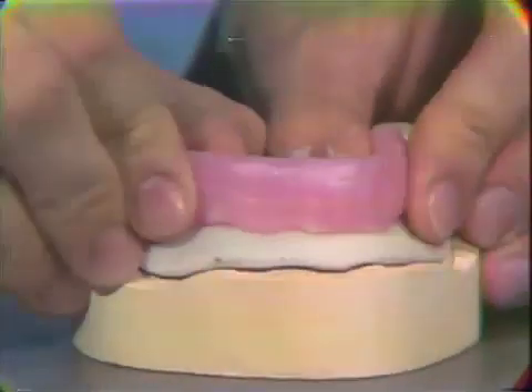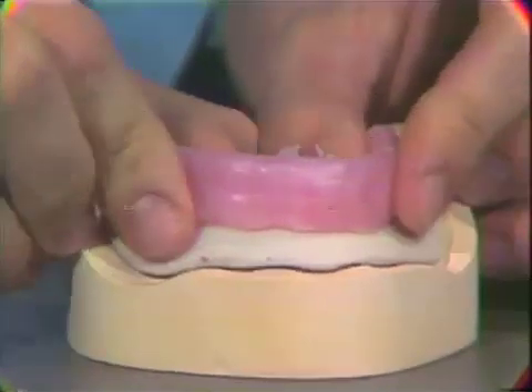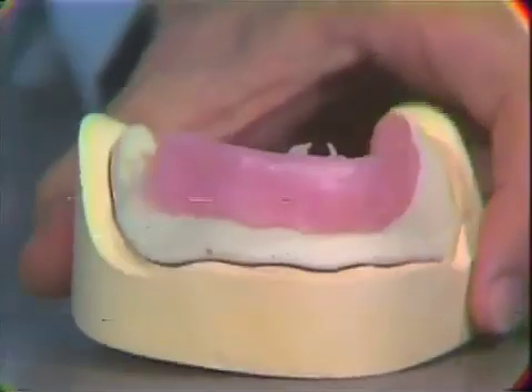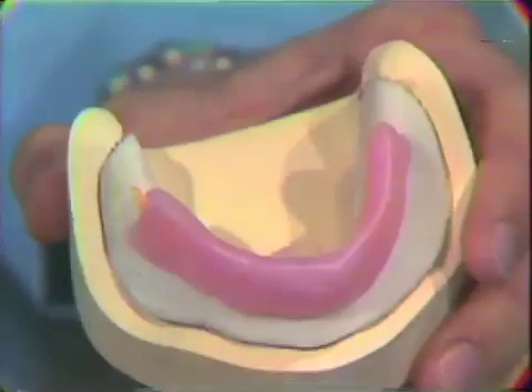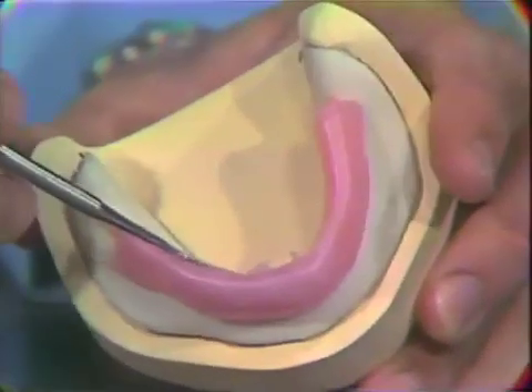It is positioned approximately in the middle third of the base plate and its height should be approximately a centimeter. Of course, this will vary with your clinical patients and it will also vary particularly in relationship to the retromolar pad.